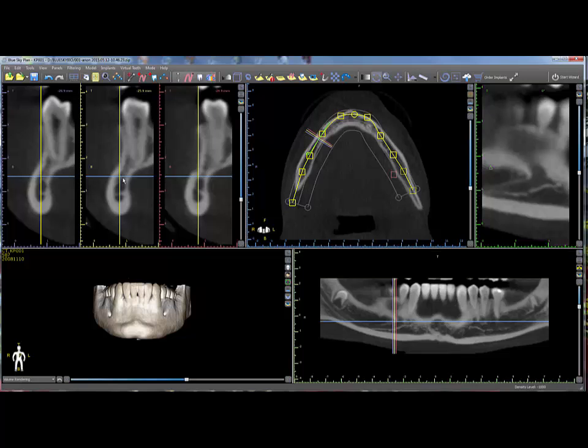Identifying the nerve makes it prominent visually, as well as allowing the software to warn the user if an implant is too close to the nerve.